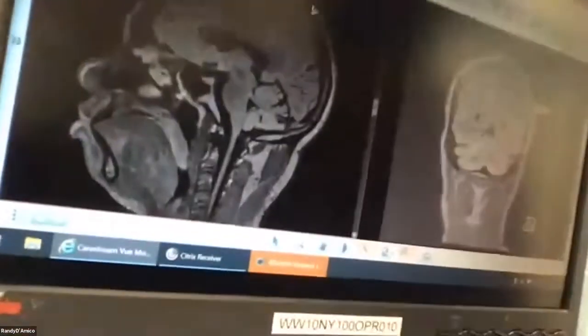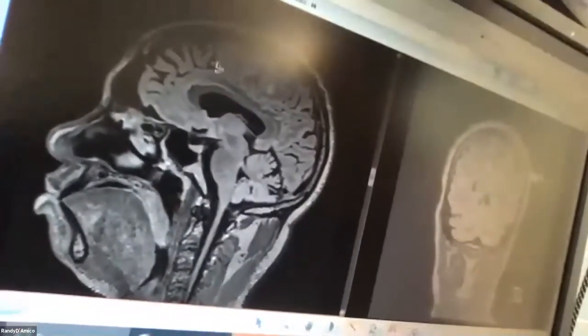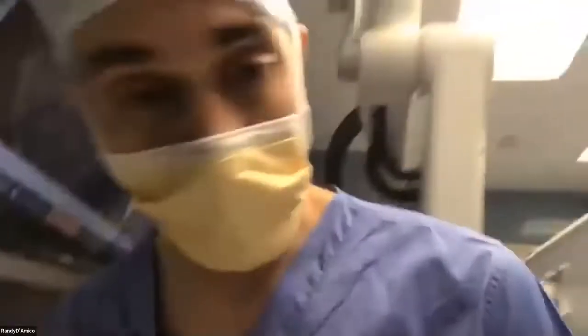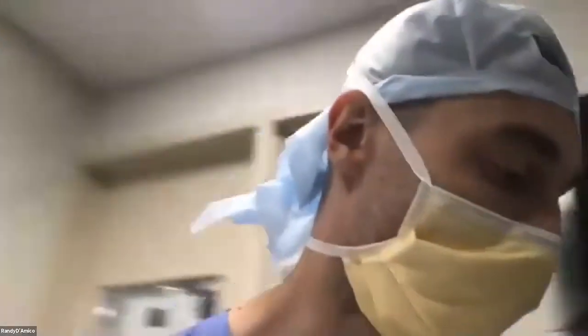I don't know if you can appreciate this or not, but this is a little tough to see. We're looking up here where the mouse is at a large meningioma. It's considered parasagittal based on its location, pushing right in front of the motor strip and mainly in the frontal lobe. These are benign lesions typically. They grow off the dura. They originate in the arachnoid cap cells. In general, they do not infiltrate the brain, although that is possible with more aggressive ones.